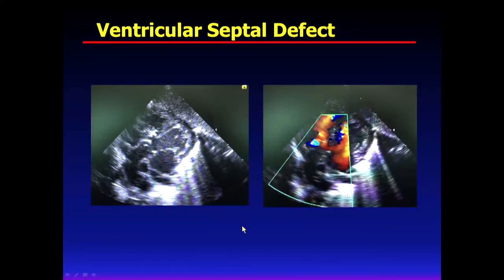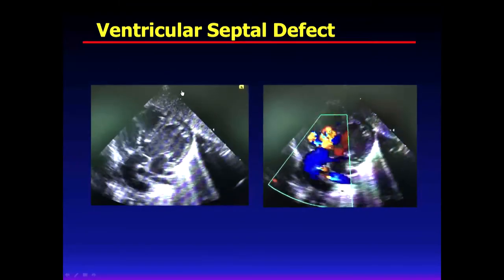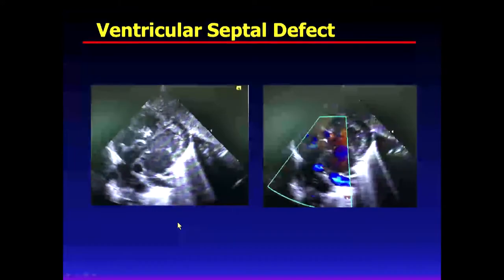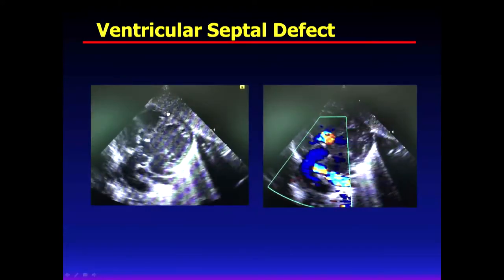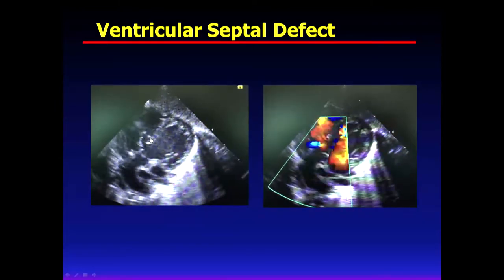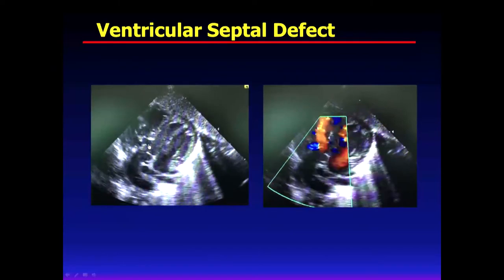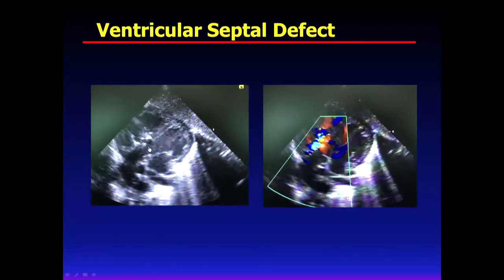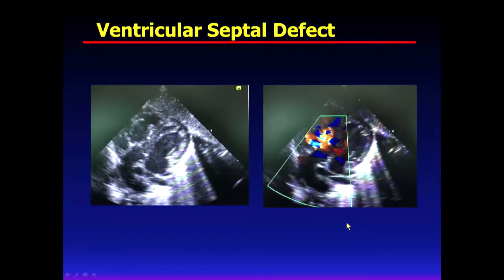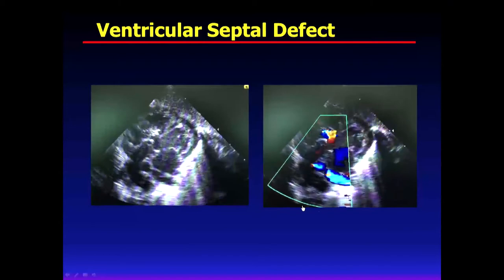And how about this, the subcostal view, baby kid. This is the liver, and this is anterior. And all the time, the posterior ventricle is the left ventricle, LV to aorta, and then here is some defect, and we notice some RV tissue and tricuspid valve tissue in there, and the defect, and then the shunt is there. So probably this is perimembranous, but whether some tricuspid valve leaflet is touching the shunt or not, we need to find that.